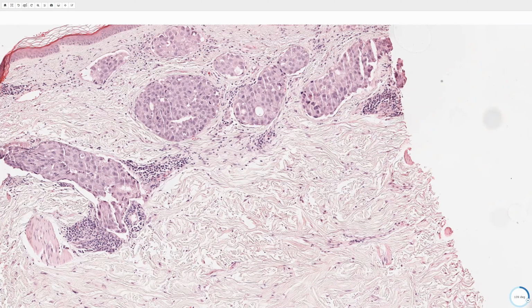And in our histologic differential diagnosis, you might think of acute myelogenous leukemia. If there were maybe more of a dense dermal infiltrate of these atypical cells, sometimes they can have some overlap and look lymphoid, but those would be positive for LCA or leukocyte common antigen, myeloperoxidase, and have slightly different cytologic characters. And then primary adnexal tumors like syringoid eccrine carcinoma would be positive for P63.